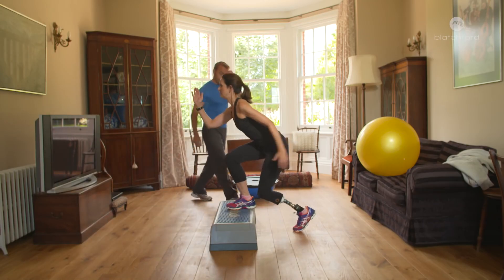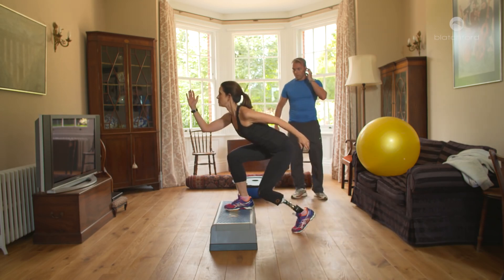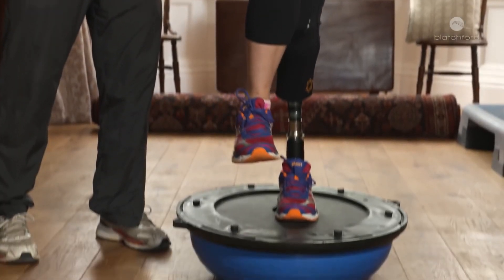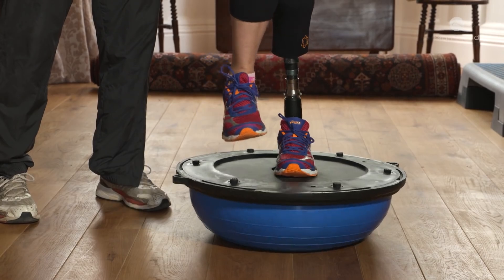The mindset has changed as well as the physical movement, which is a great relief. Knowing that I can do these things more easily without having to think about them makes me more confident, makes me try new things I wouldn't have tried before. It just makes you feel good about yourself — confident and able to do things. I don't feel like somebody with a disability; I feel fully able.